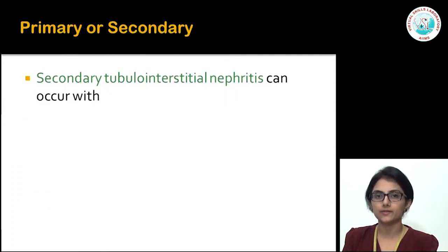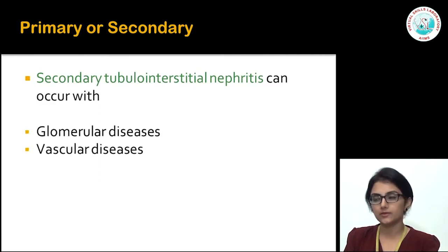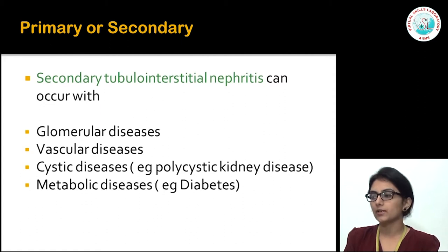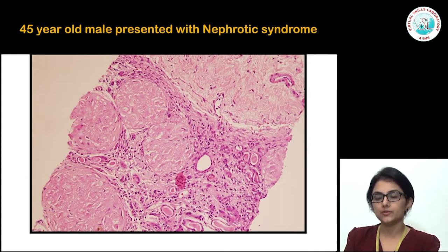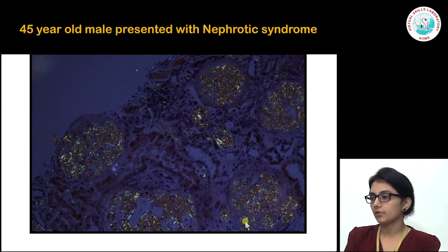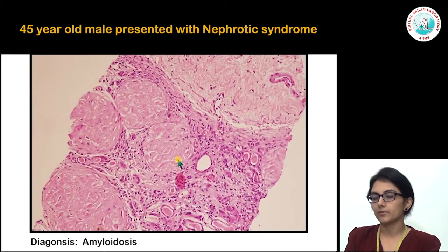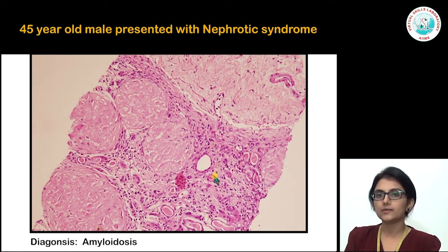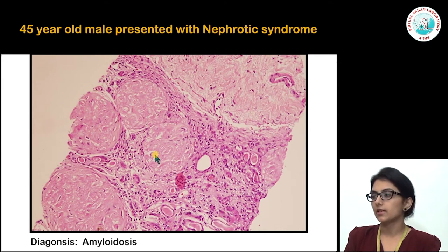Secondary TIN can occur secondary to diseases of other compartments of the kidney — glomerular disease, vascular disease, cystic disease, or metabolic diseases like diabetes. Here we have a renal biopsy from a 45-year-old male who presented with nephrotic syndrome. The predominant involvement is in the glomeruli, replaced by abundant eosinophilic material showing apple green birefringence on Congo red stain — glomerular renal amyloidosis. But the tubular interstitium is also abnormal, with atrophic thyroidized tubules and interstitium expanded by collagen with chronic inflammatory infiltrate — secondary tubular interstitial involvement.